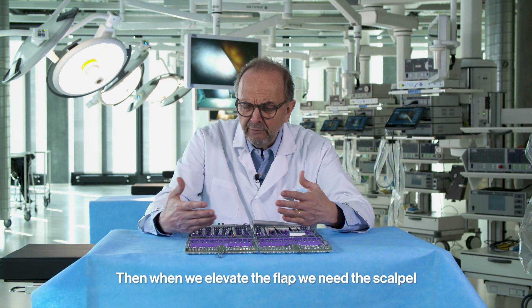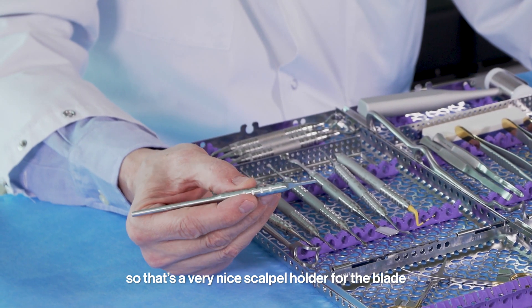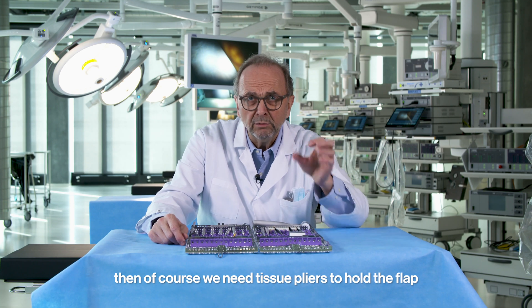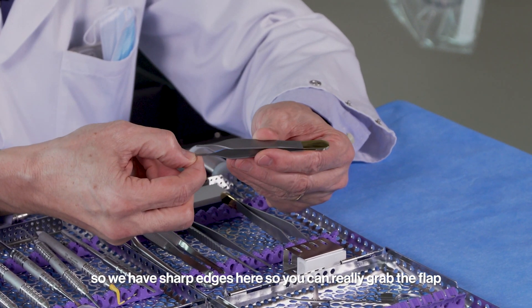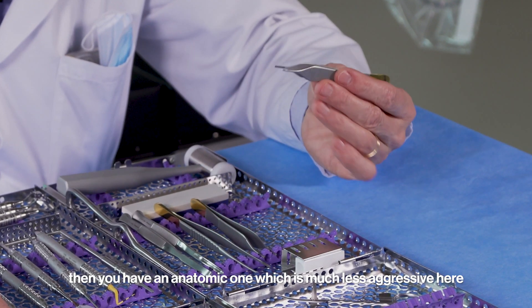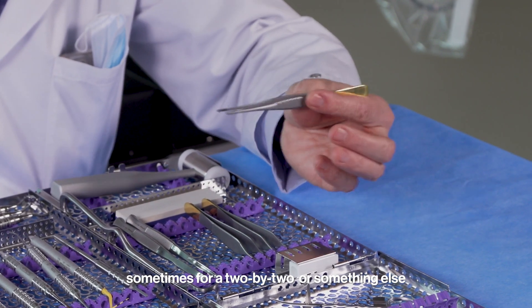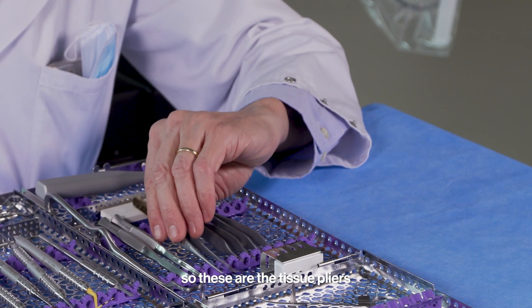When we elevate the flap, we need a scalpel. This is a very nice scalpel holder for the blade — rounded, easy grip, very elegantly designed. Then we need tissue pliers to hold the flap. There is a surgical one with sharp edges to really grab the flap, an anatomic one which is much less aggressive, and a third very long one for when you go deep inside a cavity.